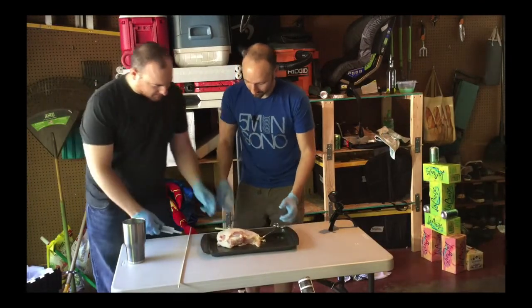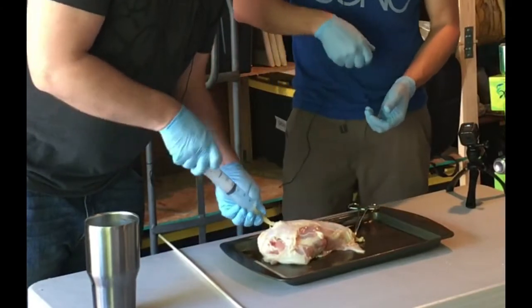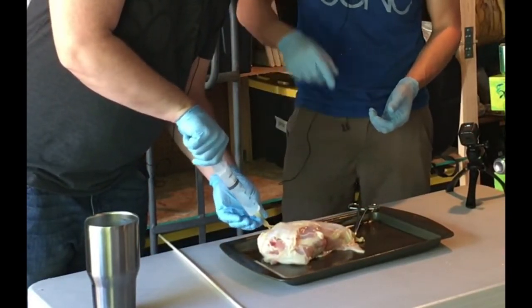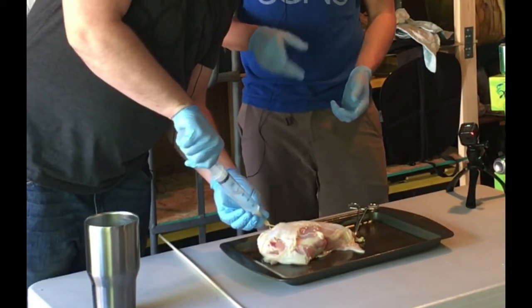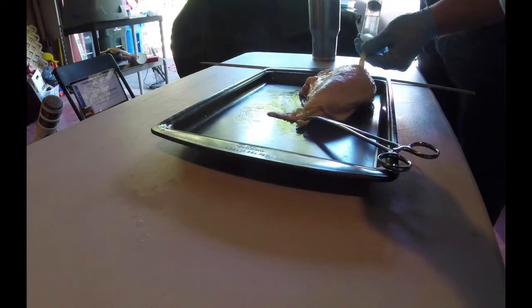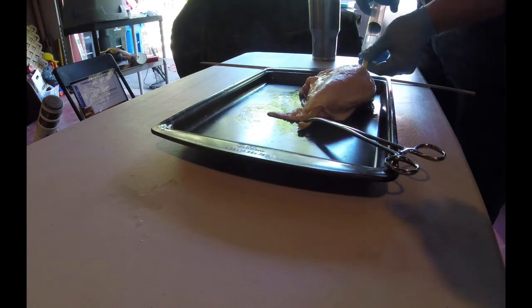Then Jason, do you want to do the honors? So with the syringe, you have some water in it already, but you want to pull back a little bit to get all the air out of it. You see all these bubbles are kind of coming out of it. Bring that back until you stop getting air bubbles — basically till it collapses a hundred percent. Then push it in, fill it up. If you had a second set of forceps, you could put one on the other end, but we're just going to keep that syringe on there.